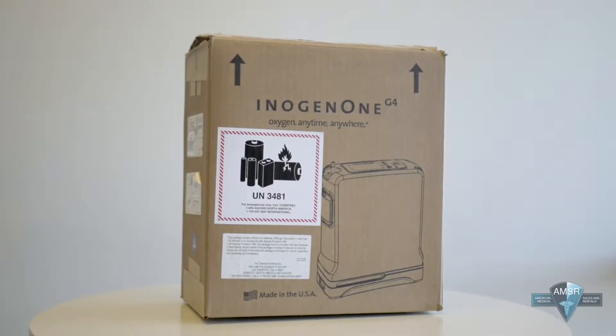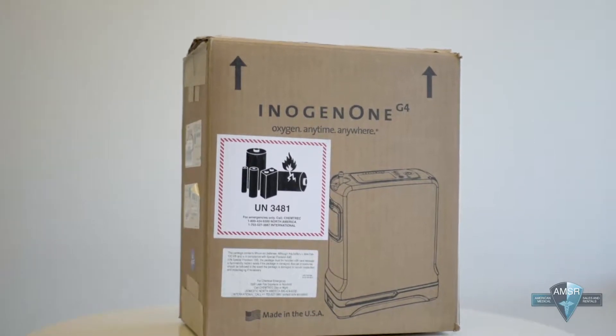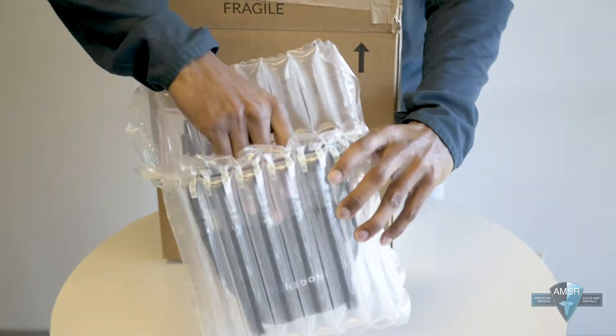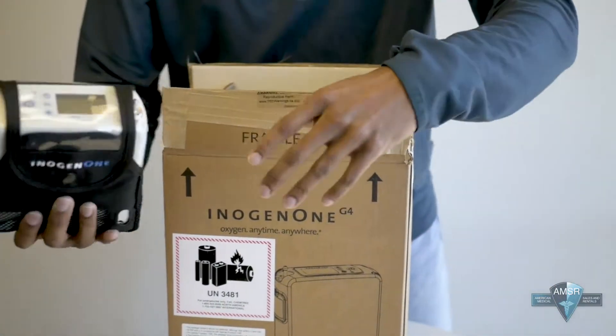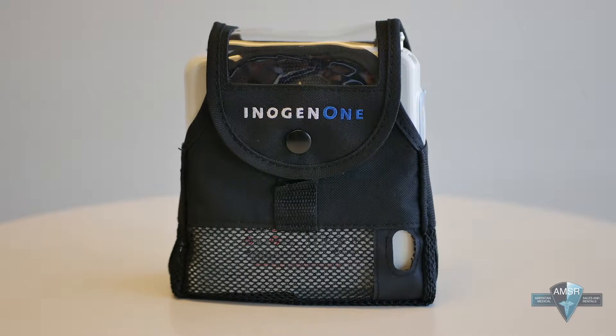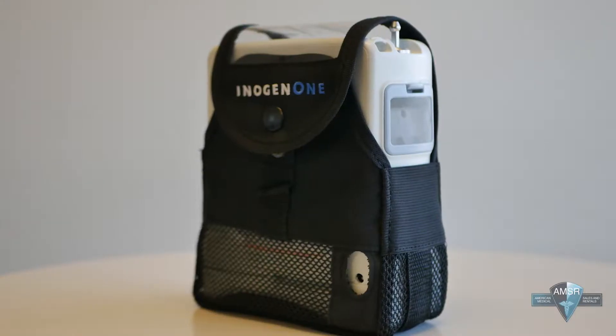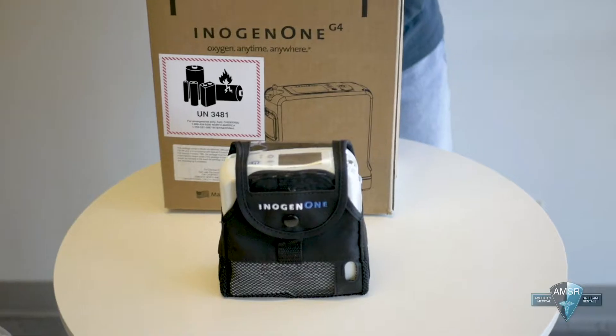So without any further ado I will do an unboxing so you can see exactly what you get with this particular machine. When you get it, the machine comes in real nice safe packing material, and this is the machine itself. As you can see it's pretty small and lightweight, and it comes with the carry case already on the unit.